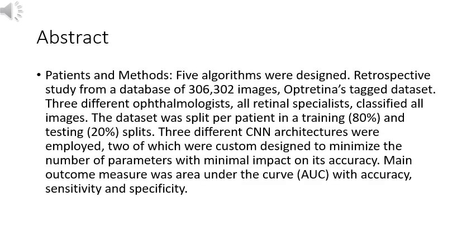Patients and methods. 5 algorithms were designed. Retrospective study from a database of 306,302 images, Optretina's tagged dataset. 3 different ophthalmologists, all retinal specialists, classified all images.